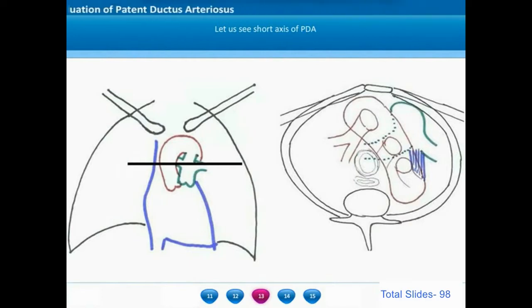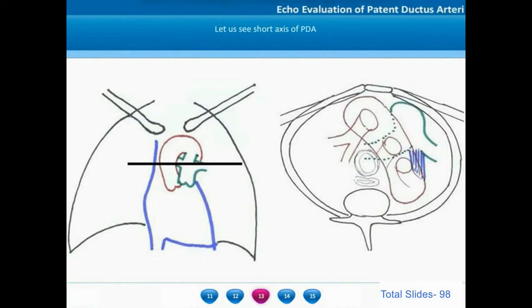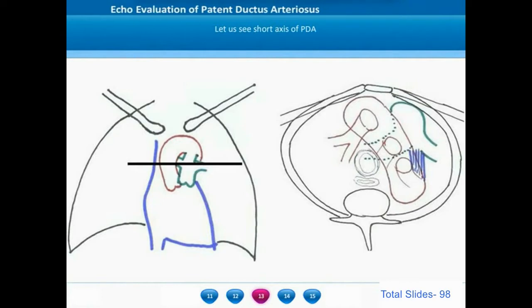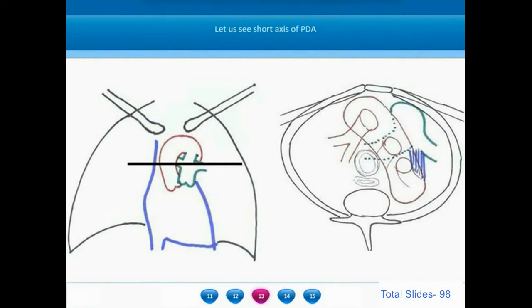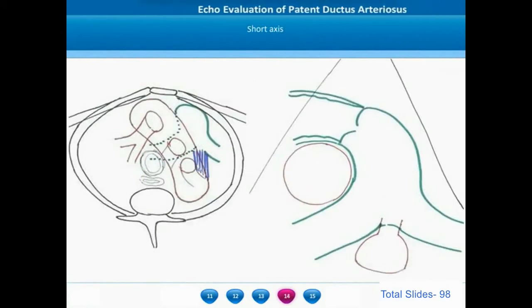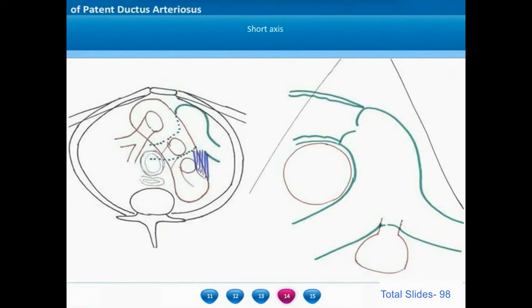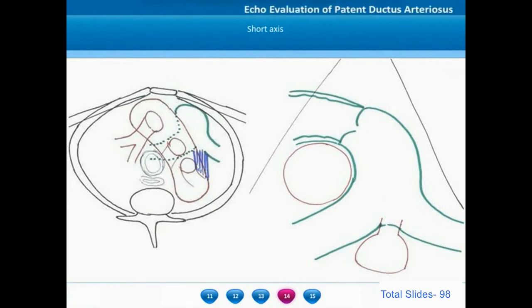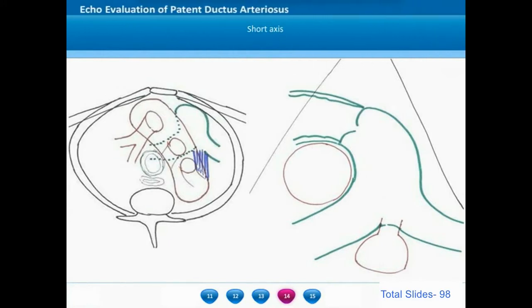In the short axis view of the ductus, we are exactly perpendicular to the previous plane. The previous ductal view was along the sagittal plane; here we are in a horizontal plane. On the cartoon, we identify the ductus arising from the anterior wall of the descending thoracic aorta and inserting in the pulmonary artery bifurcation. In this short axis, we see the right ventricular outflow tract, the pulmonary valve, the main pulmonary artery, the pulmonary artery bifurcation, and the ductus inserting into the posterior region of the main pulmonary artery bifurcation, with the descending thoracic aorta more posteriorly.